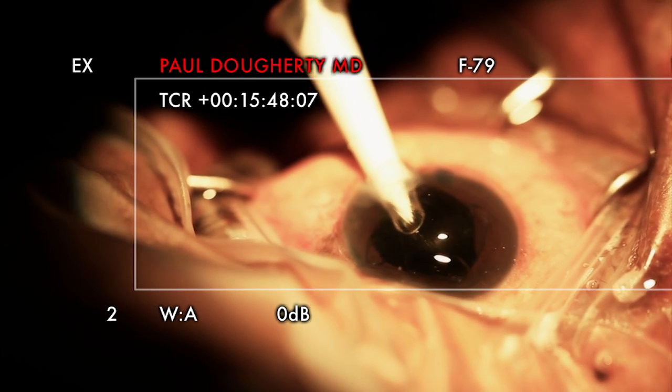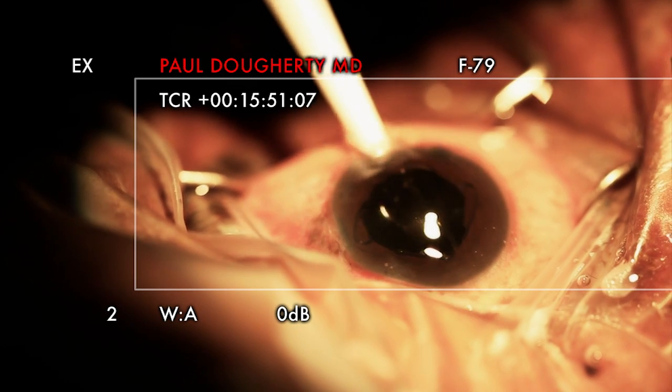Fibrotic capsule, small pupil, and glaucoma — and essentially a mature cataract. It was white — sneaky eye.